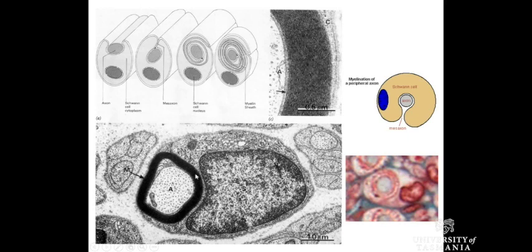and then here's our myelin sheath, which of course under electron microscopy, lipids are often stained varying levels of electron density. Here, myelin sheaths are often stained very electron dense, so you have these black lines which under this higher magnification look like this. Remembering we wash away most of the lipids for light microscopy, so it has this weird sort of spoke-like structure.